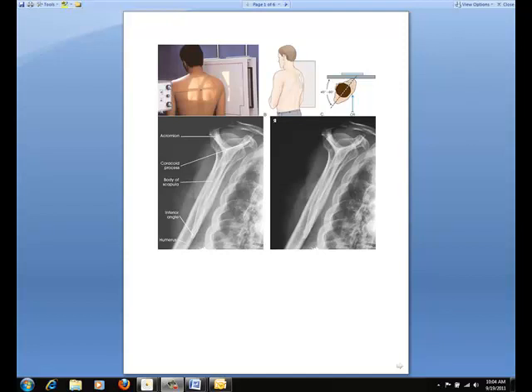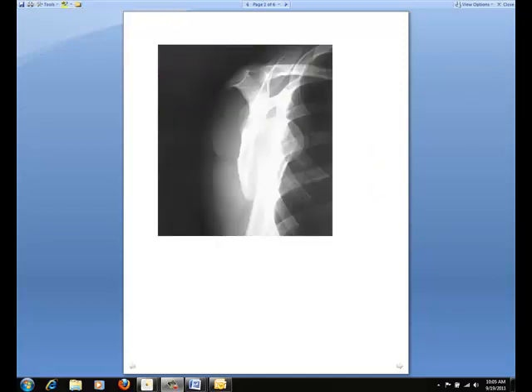On an additional note, this can also be performed in an LPO or RPO position, but do note that this will result in magnification of the scapula. This image demonstrates a PA oblique shoulder joint showing an anterior dislocation.